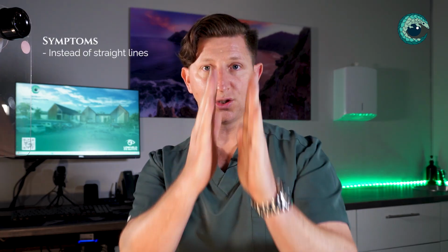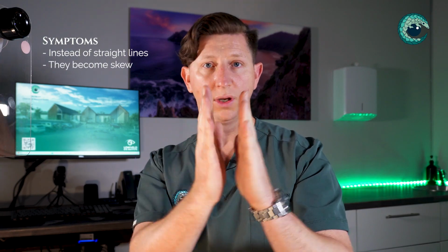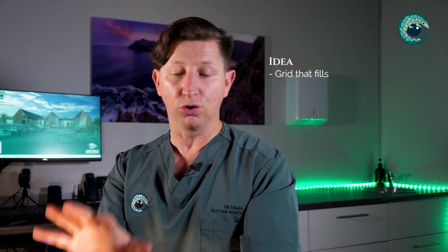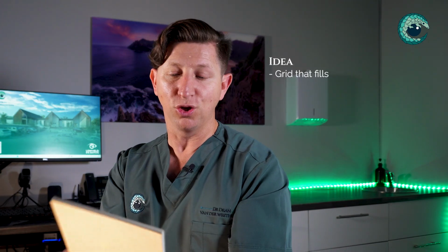So issues with the macula cause central vision issues, and probably the most common and well-known is age-related macular degeneration. One of the symptoms that you will notice is that instead of lines being straight, they start to become skew in different orientations. Some people may say burglar guards. In South Africa we've got lots of burglar guards, so burglar guards may be a bit skew. Lines on the roads, door frames may be a little bit skew. Patients may notice that. The idea behind an Amsler grid is to give a grid that fills most of the macula when you're looking at it.